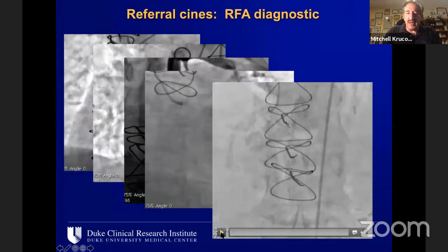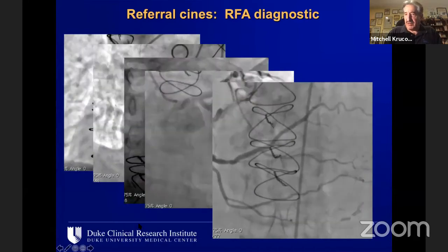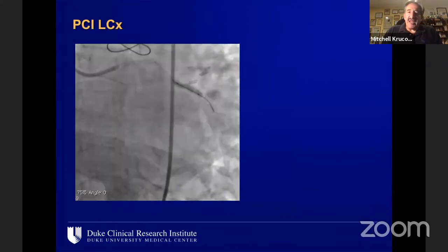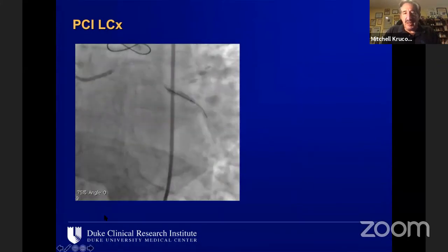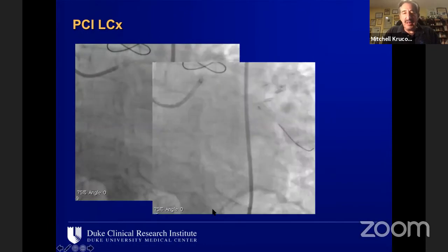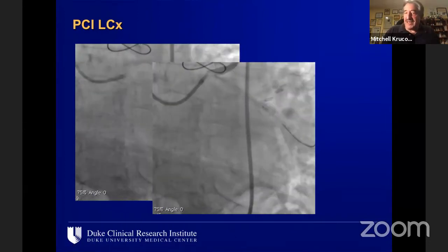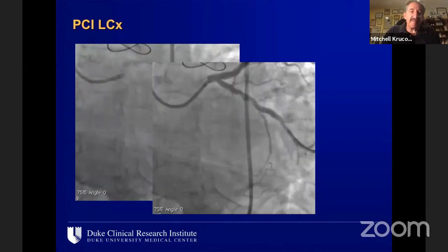And then the right coronary artery, you can see the calcium stem to stern, and we'll talk a little bit more about this as the case goes on. So what they did, these are the only two pictures that they conveyed. This is a balloon in the marginal near the proximal lesion. And then we usually take a final shot without the wire, but this is the only shot they have. But I think it looks like it's probably a pretty good result in the circumflex artery.